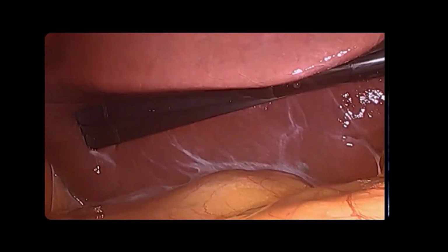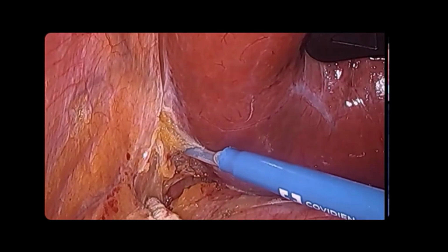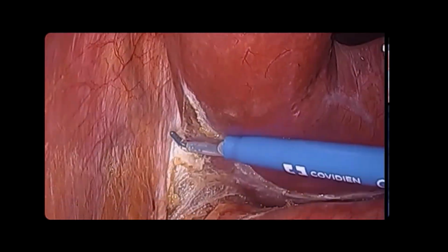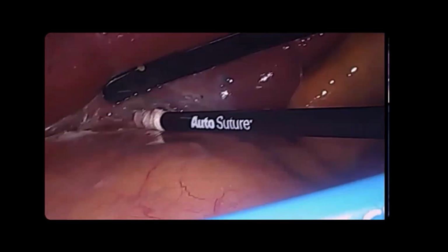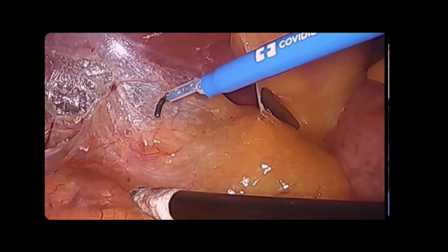Up next, the fan retractor. This is plastic with multiple what I call fingers. There are metal versions of this. I think this is better than the Nathanson retractor, but it still has the issue of the individual pieces causing undue pressure on the liver that can lead to bleeding. In addition, I find it tends to slide around on the liver more than a paddle retractor, and that pressure and distraction at the interface of the liver and vena cava medially is just not as good either.